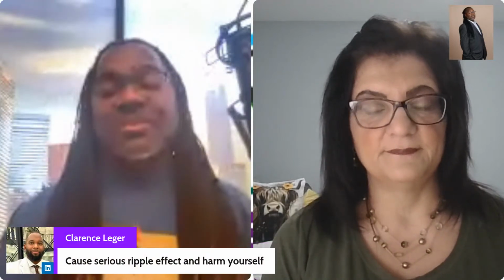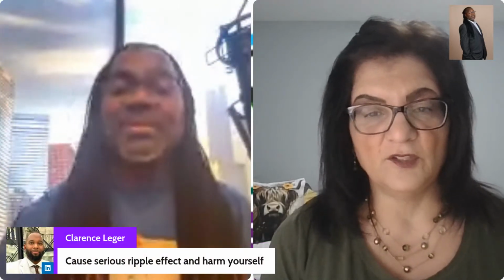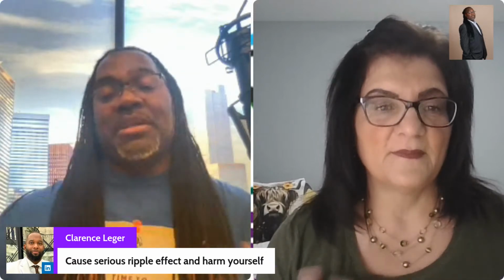So what do you do? Well, in the PPE, you should have the shoe covers, the gown, the gloves and the mask. On the scrub issue of changing out of decontam, if you wore all your PPE correctly, I think as long as you remove it and wash your hands, because that's what I did. And I've seen people who are just completely soaked, and I don't understand that either. But again, that never happened to me. People sweat. They get hot, and when you're moving around, it does get warm if you've got the gown and everything on.